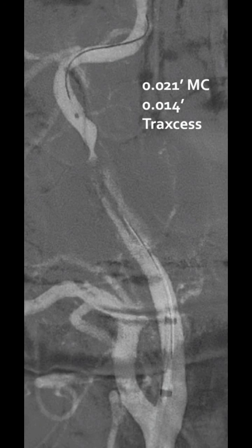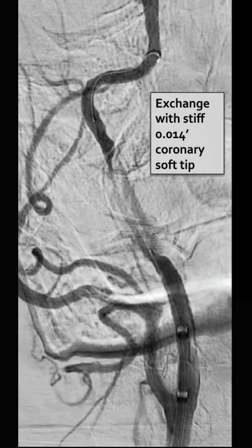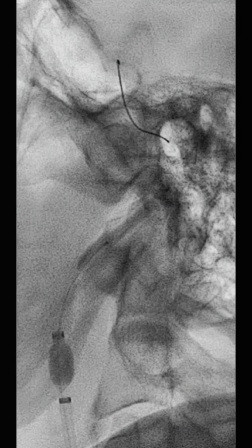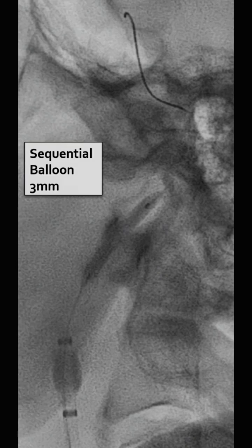It is important to traverse this segment through the true lumen and therefore a microcatheter and microwire was used to go across. Thereafter, the 014 wire was exchanged with a stiff coronary, soft tip wire and sequential balloon angioplasty was performed with proximal flow arrest.